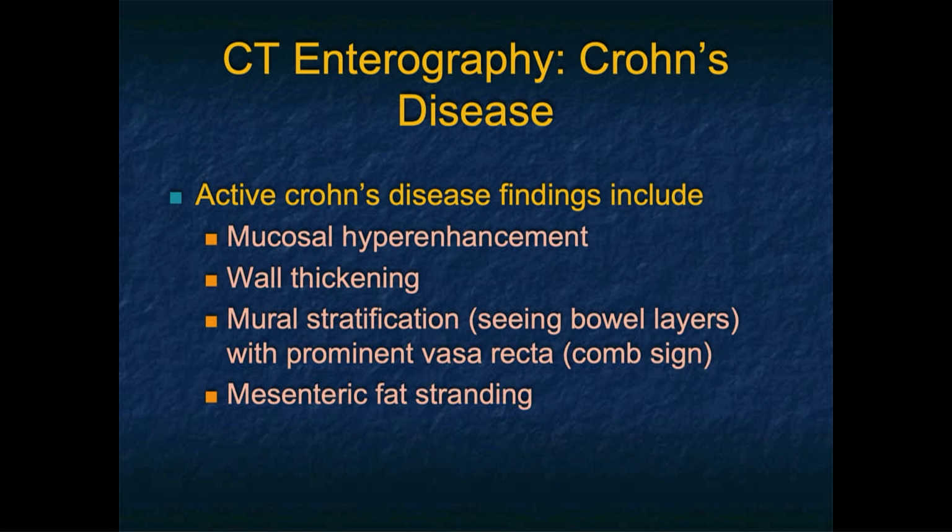Now in the ER setting, we also see lots of patients with Crohn's disease. CT has been used in Crohn's disease, MR is used in Crohn's disease. Sometimes we know the patient has Crohn's, often we don't. Crohn's is a very good example of inflammatory bowel disease because it gives you many of the key features, from mucosal hyperenhancement to wall thickening.